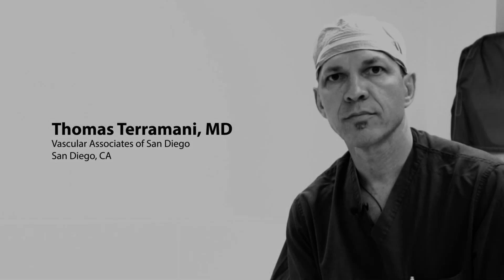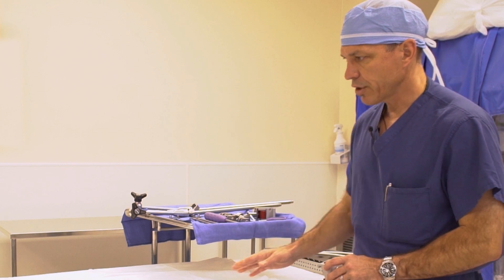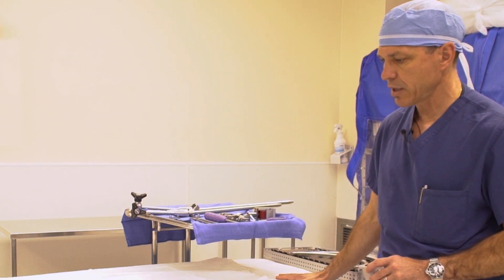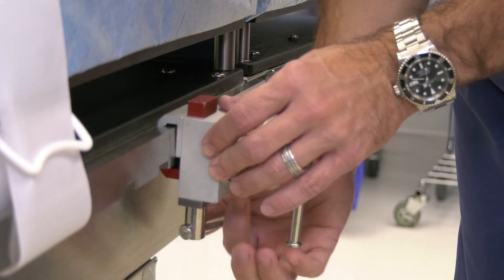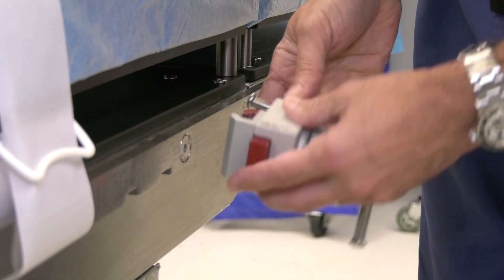We're going to talk about the setup of the retractor system and we'll start from the beginning. We're going to assume a patient's on the table — head of the table is here, tail of the table is here. We're going to put our first clamp. You have an option to put the clamp this way, or you can also place the clamp this way.